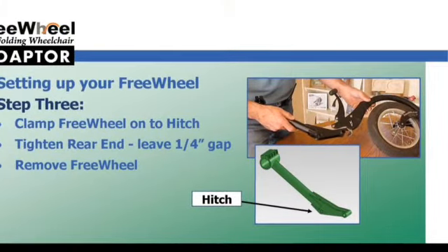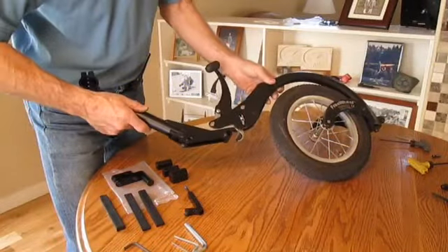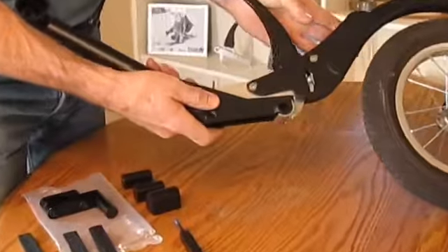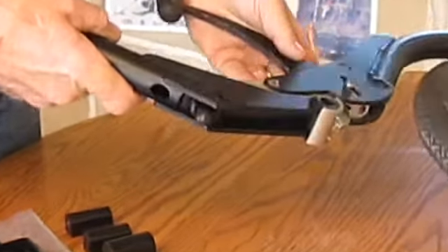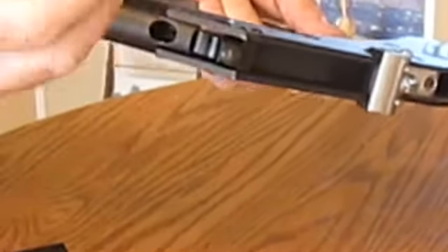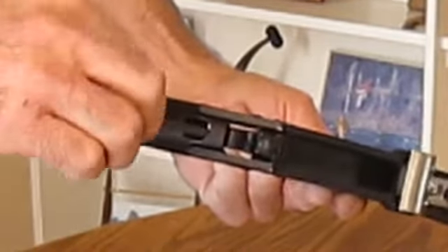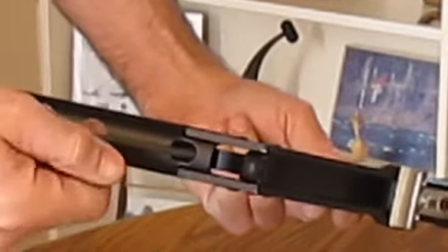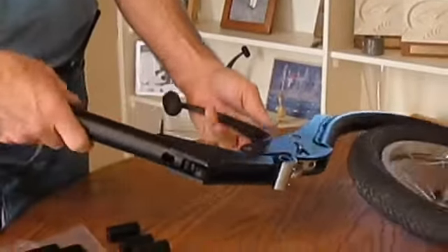This next step involves taking the FreeWheel and clamping it onto the hitch. Install the FreeWheel onto the hitch and close the handle of the FreeWheel. Once it is secure, turn the hitch over and insert the Allen wrench into the hole at the bottom of the hitch and finish tightening the rear end. The connection should be nice and secure. Now remove the FreeWheel from the hitch before the next step.